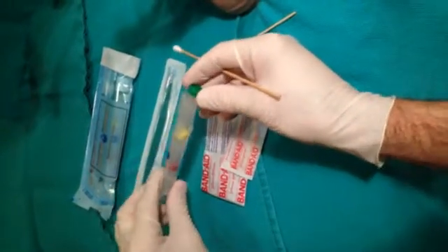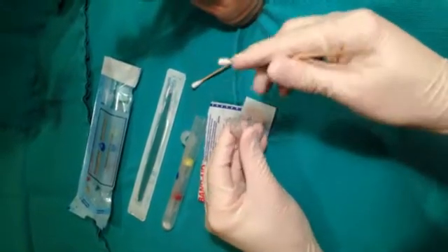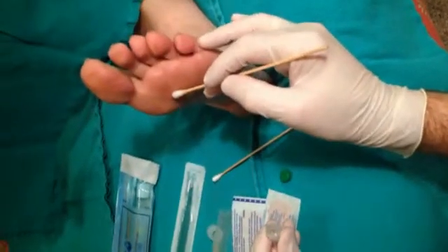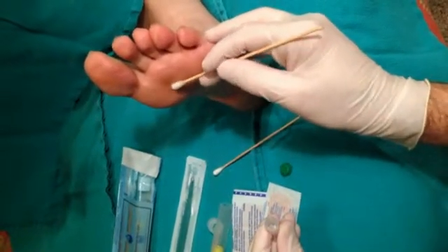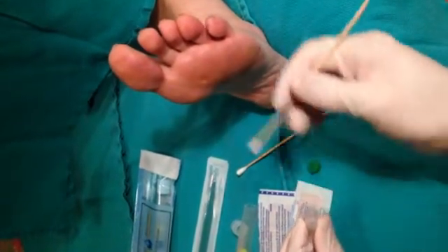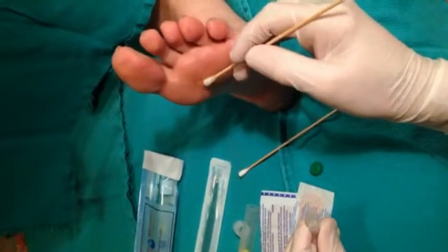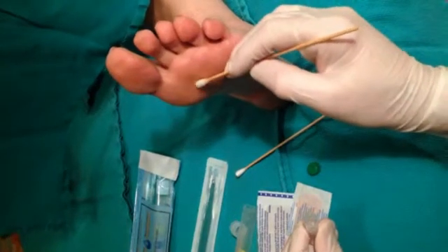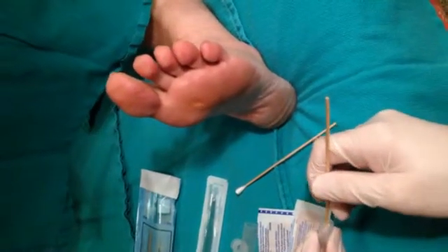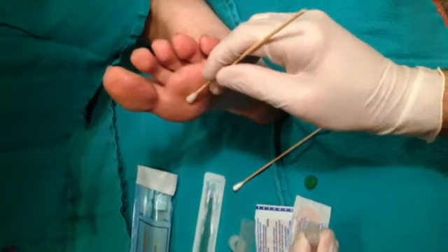The first one we'll be taking out is the green solution, and we will be applying that to the lesion for approximately one minute — literally just touching, pressing, and reintroducing to have more moisture from that solution applied to the lesion. As you can see, I am depressing the tissue. It appears wet — it will never appear dry. You just want to keep applying the solution even though it appears moist already.